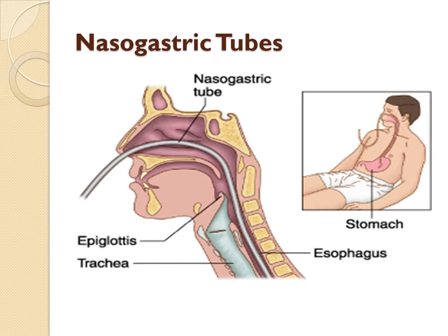As you can see with a cross view of the NG area, you're looking at the nares, followed by the pharynx down the back, and then eventually the esophagus. You'll see that the epiglottis is over the area that will protect the trach. And then you see, if you look at the second picture on there, it does point to the stomach organ itself.